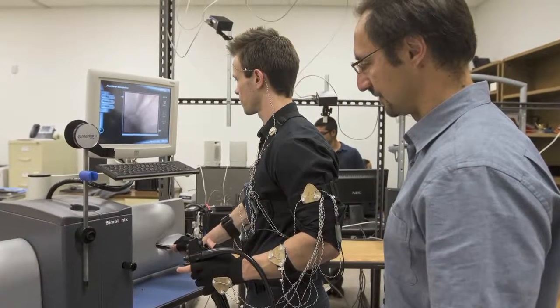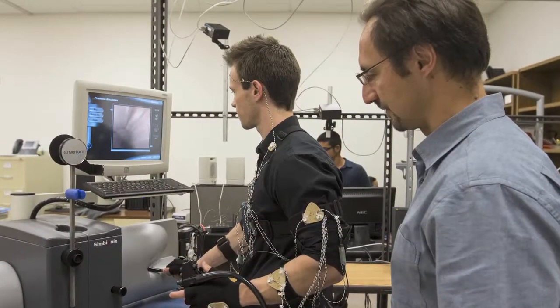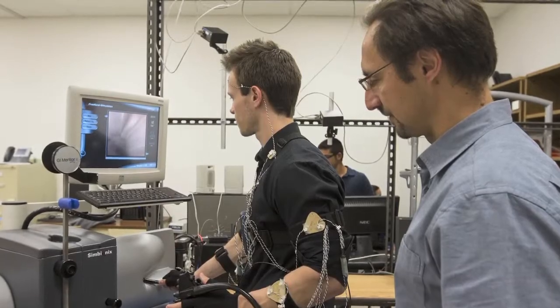And when we started to actually look into it, we talked about different ways to set it up. One way was to actually study the procedures as they happen. We then came up with the idea of using simulators because they've been used in the training of endoscopy, and we thought it'd be useful for the study so you could get a reproducible methodology. We worked with Simbionix out of Mentor, Ohio, and they provided the simulators for the study. They're one of the simulator companies that many people use. And then the technology, I was really not aware of the different sensors that existed, and that's what I learned from you.